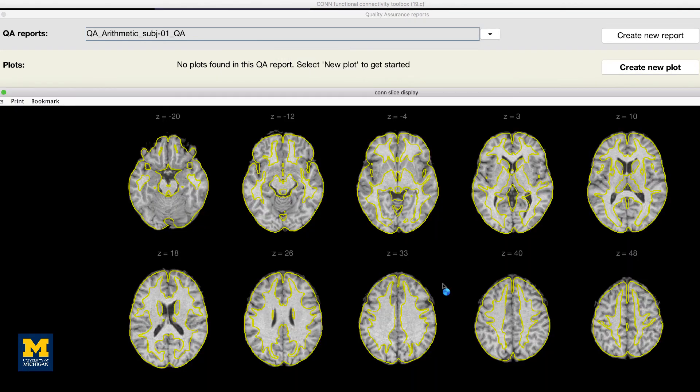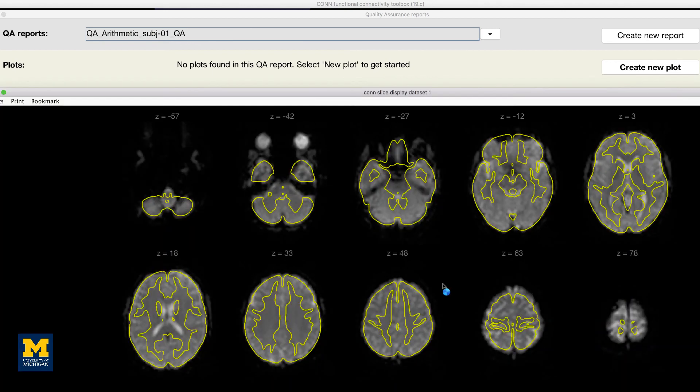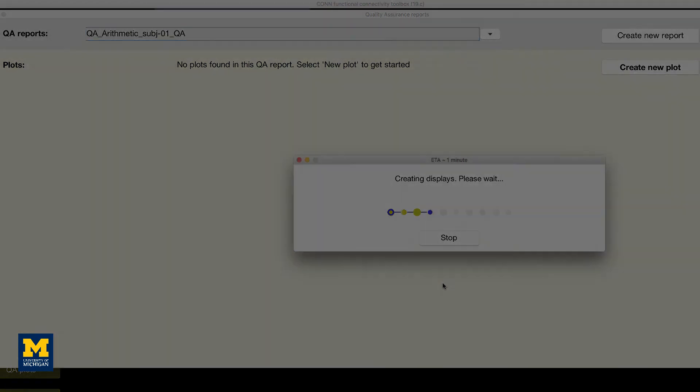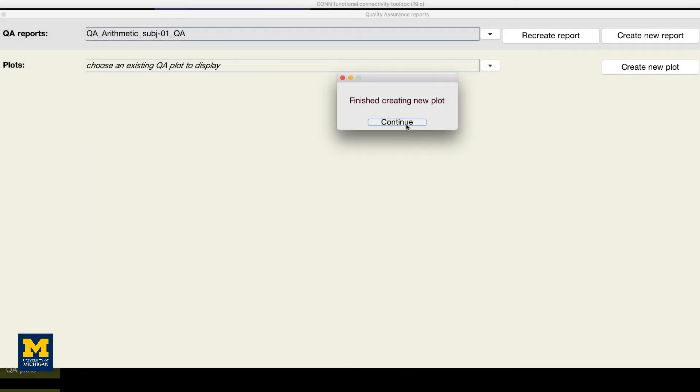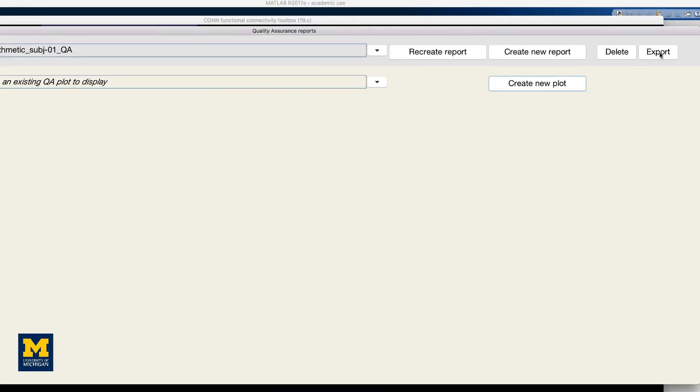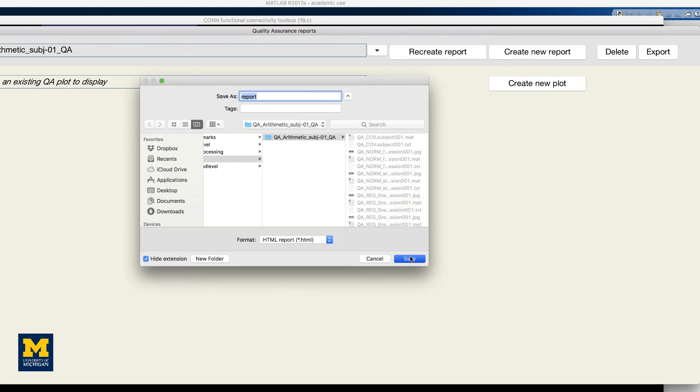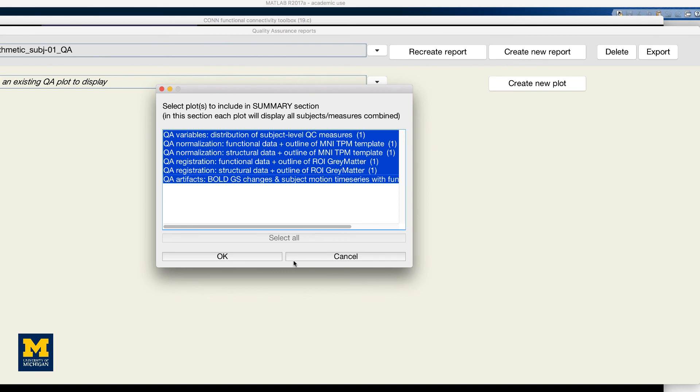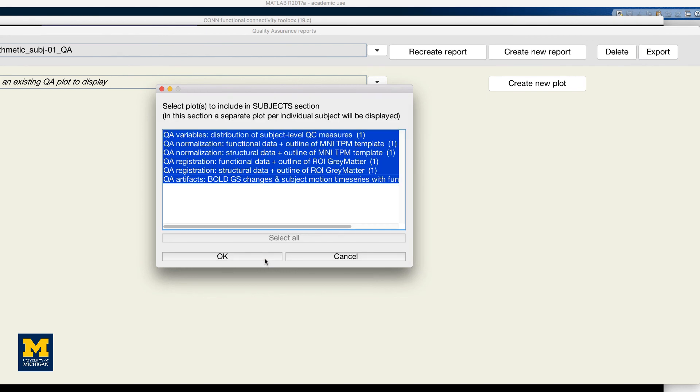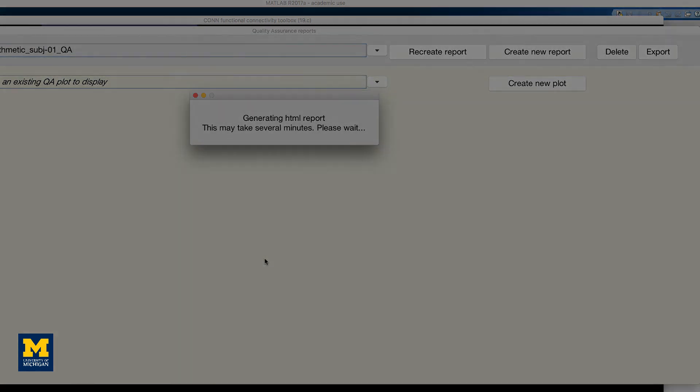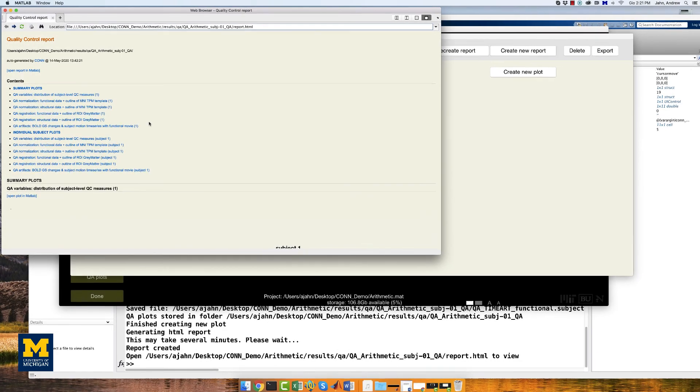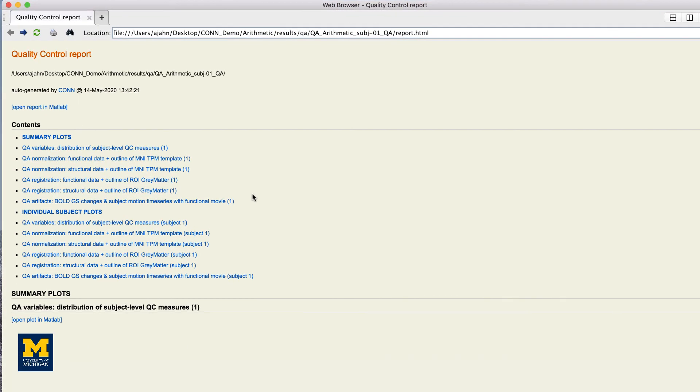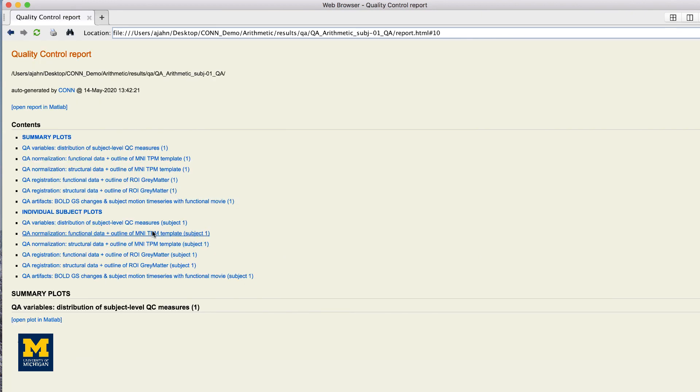A series of figures will be generated, one for each QA check that you selected. You can then click on the export button to generate an HTML file of all of your QA checks. When it is finished, you will see something like this that you can open up in your web browser and click on the links to review any of the preprocessing steps.